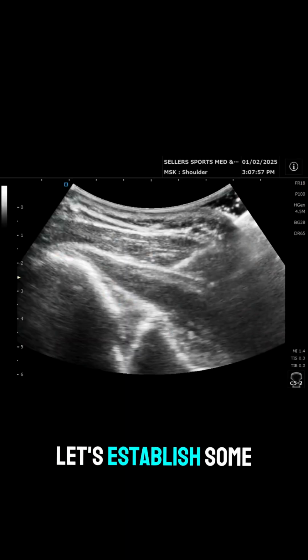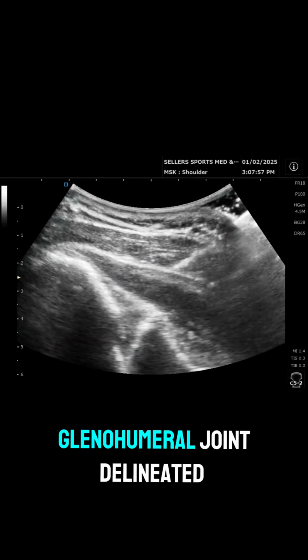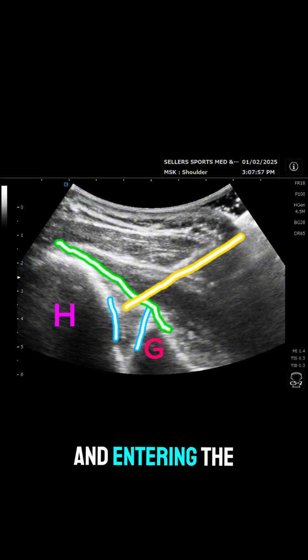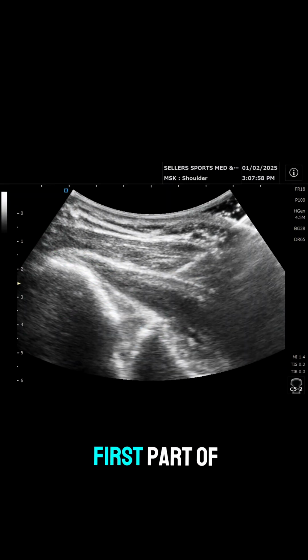Let's establish some anatomy. This is the glenohumeral joint, delineated by an H and a G, the ball and socket. In between is the joint space, and overlying this is the joint capsule. You see the needle actually coming in and entering the joint space. Now on to the first part of the procedure.